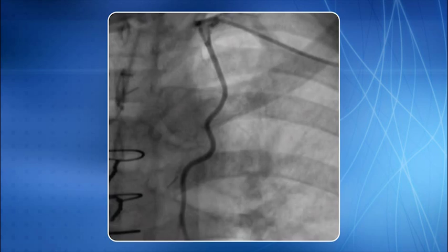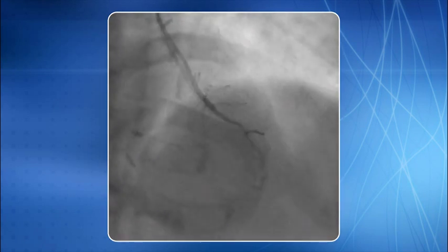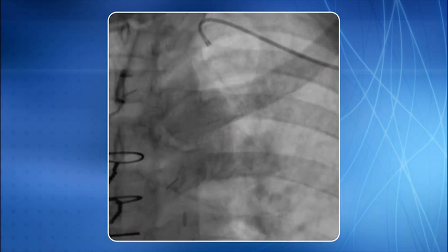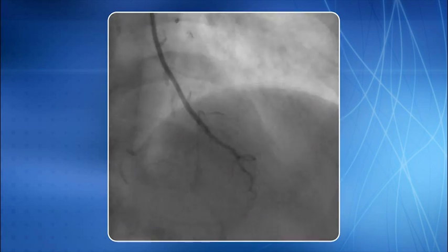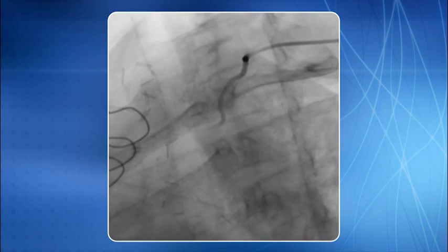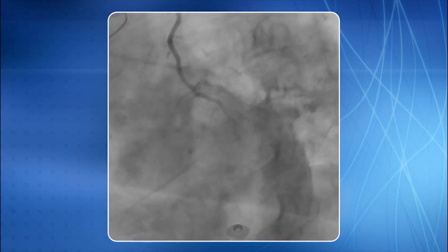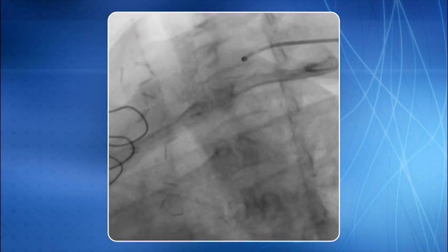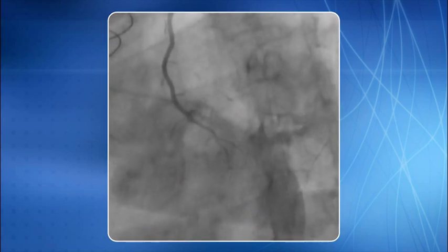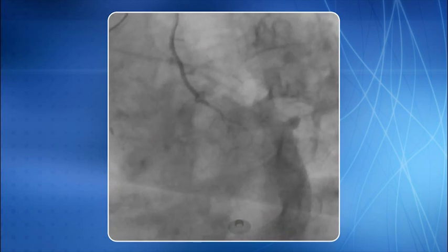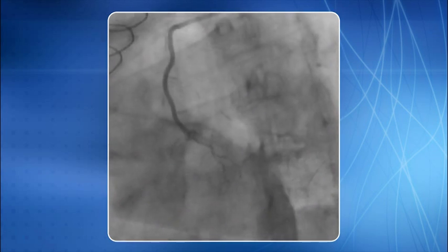Here is an example of LIMA graft cannulation using a 5F IMA diagnostic catheter through the left radial route. For beginners, we strongly recommend the use of the left transradial approach for cannulating the LIMA graft, as it is quite easy to do so.